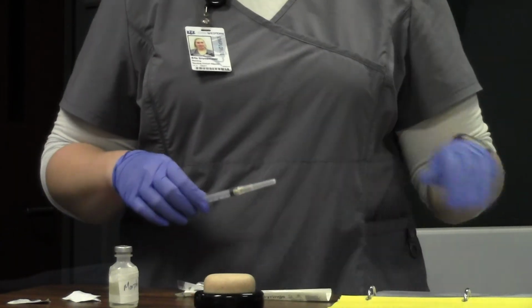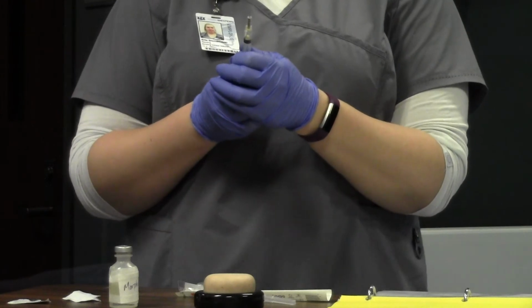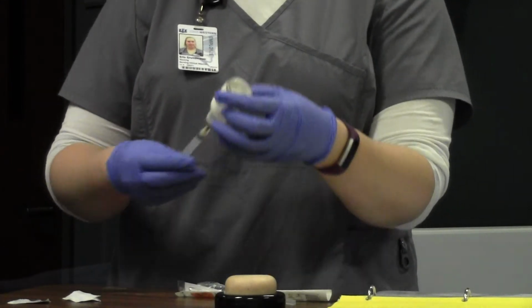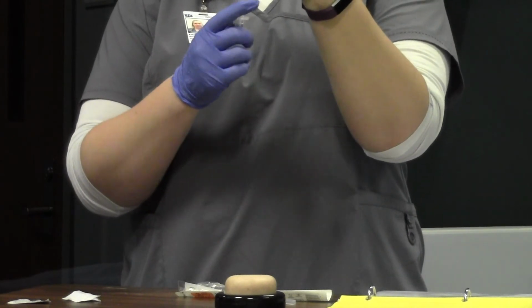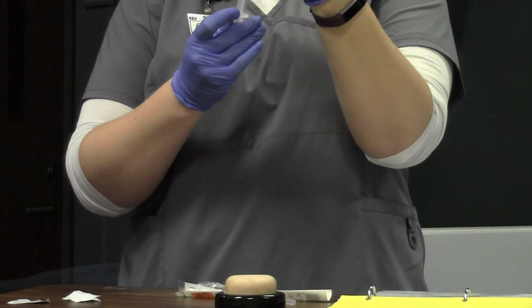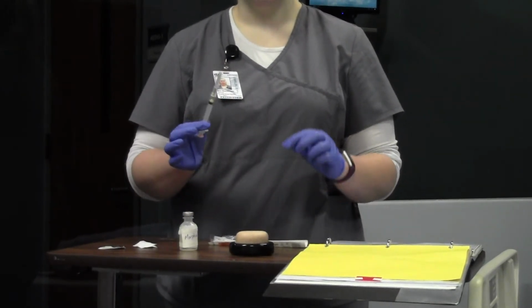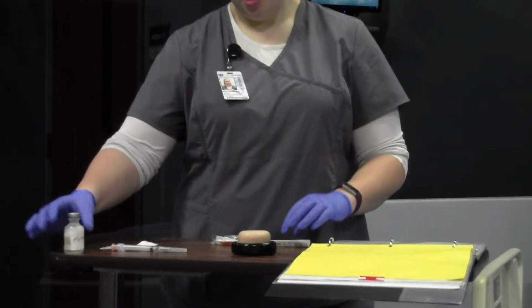Now I want to give 1 milligram, and my vial says 2 milligrams per 1 mil. So that means I'm going to give half a milliliter to give the 1 milligram of morphine that I would like to give. I'm going to then inject air. I'm going to draw up. Morphine is also a controlled substance, so you should have to do a 2-nurse check with your morphine. So I would show my nurse that I'm going to give half a mil, and it is 2 milligrams per mil. I'm going to then do the scoop method to put the cap back on my needle and get ready.